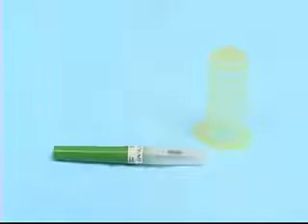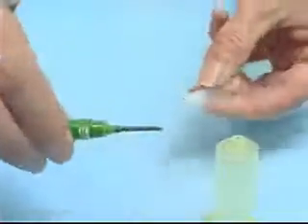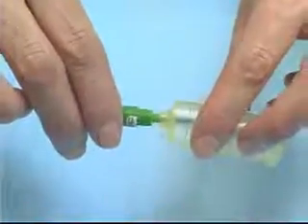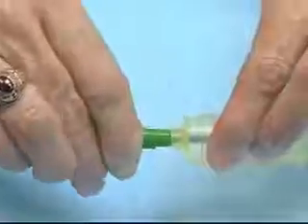In order to use the vacutainer we need to put the vacutainer needle inside the vacutainer holder. I'm going to remove the clear end from the vacutainer needle and insert it into the vacutainer holder, and it screws tightly into place.